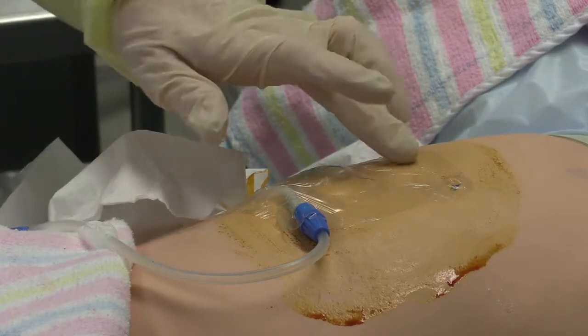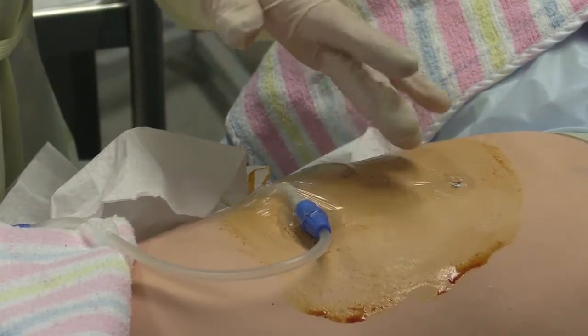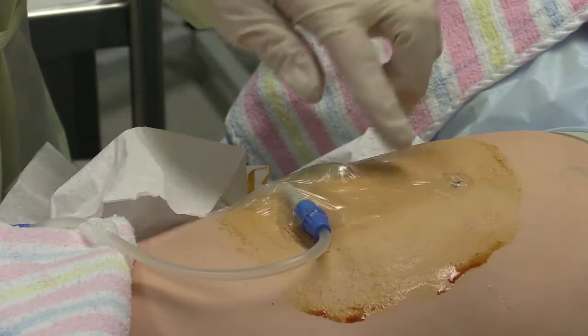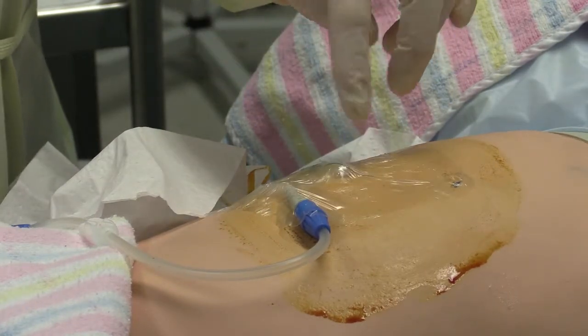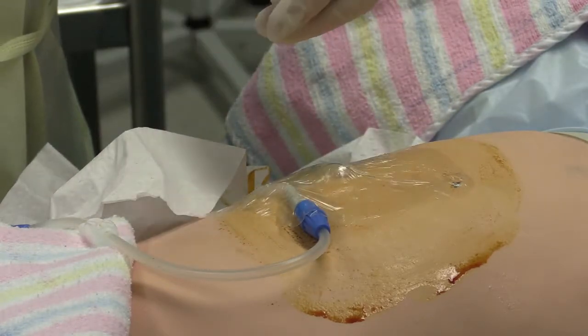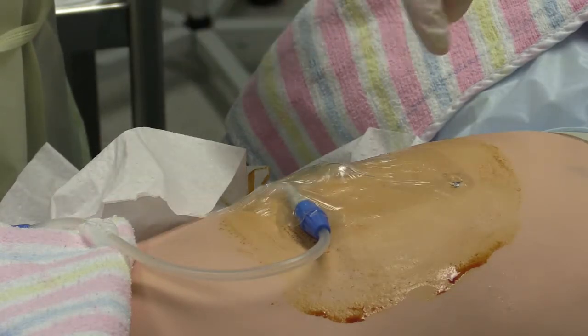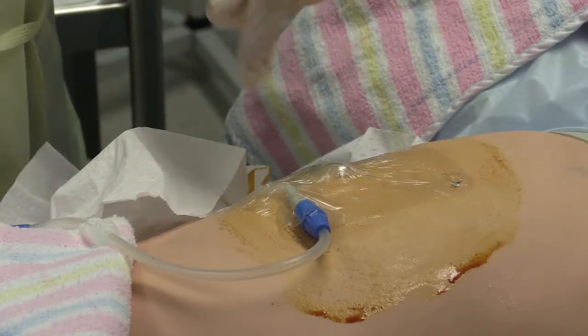The dressing should be left in place until the catheter is removed at the end of the full week, unless the catheter is oozing around the exit site, and then you'll need to take the dressing off, clean the skin with povidone iodine, dry it, and apply another dressing as we've done.